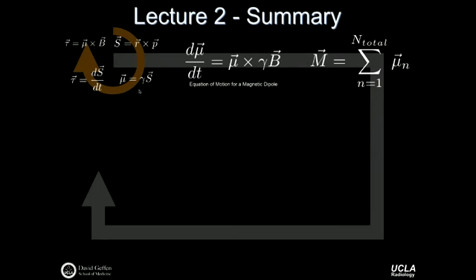This is something that's not derivable per se, but known empirically. And what we ended up doing with that was defining a system of equations for the equation of motion for that individual magnetic dipole. And then said, well, we don't really observe things at the individual magnetic dipole level. We really do this at the so-called bulk magnetization level. And so let's just add up a bunch of these and give ourselves a new equation to work with, which we call the equation of motion for the bulk magnetization.